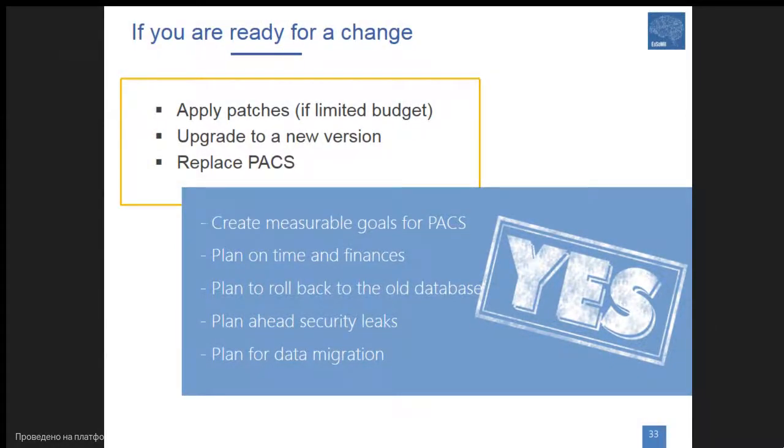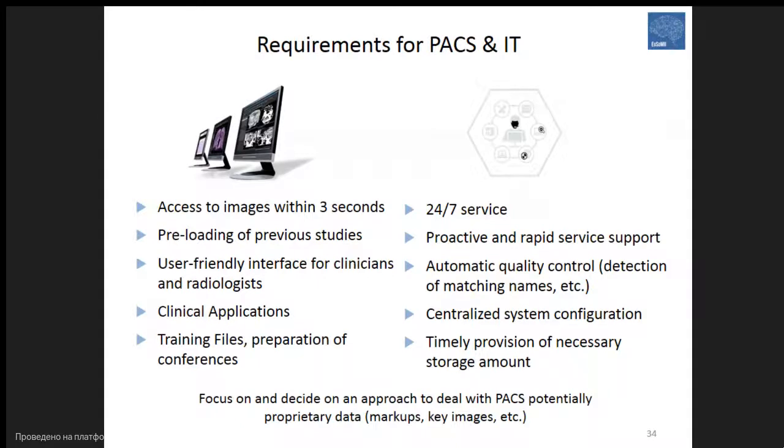If you decide to go for changes, you can apply patches with a limited budget, upgrade to a new version, or completely replace the PACS. You need to define measurable goals for the PACS, plan time and finances, plan a rollback to the old database if something goes wrong, plan ahead for security leaks, and plan for data migration. These are important steps for moving from the old PACS to the new one.